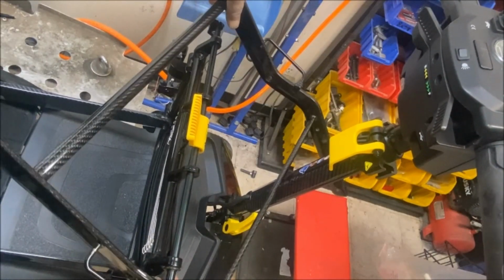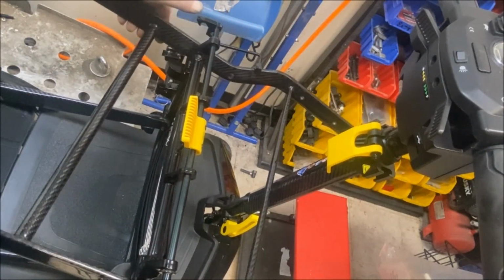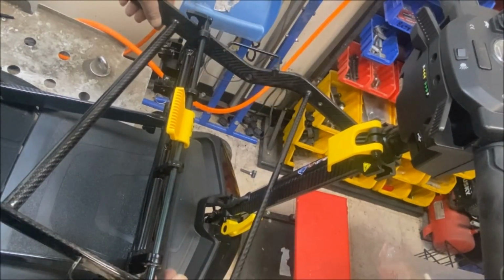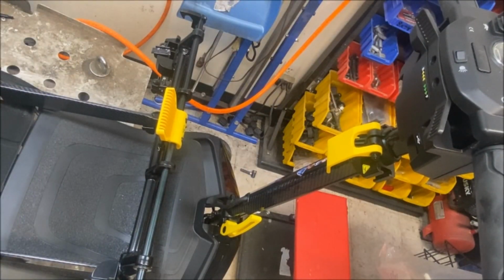Let's see if I can. I've got one side. Yeah. So it'll just fit over there like that, if you can see that. So over one side first. It'll just squeeze out and then pull it. That's lucky, I didn't want to remove that. So let's get my frame.